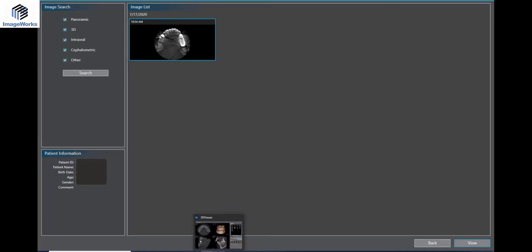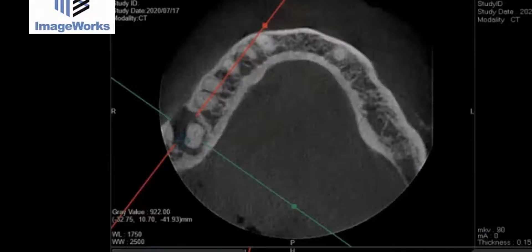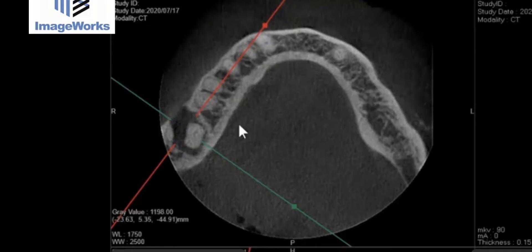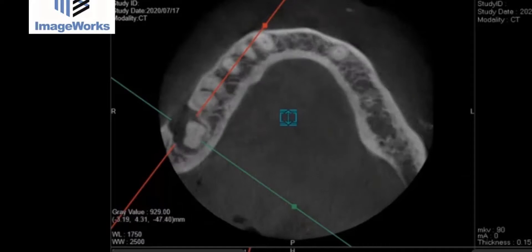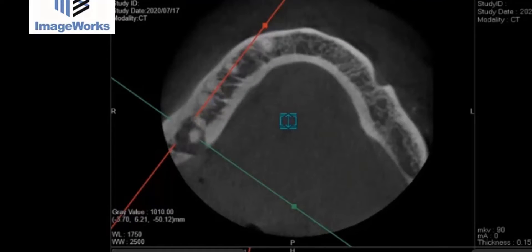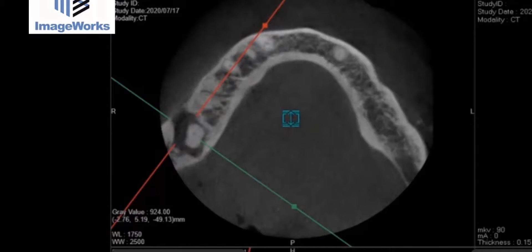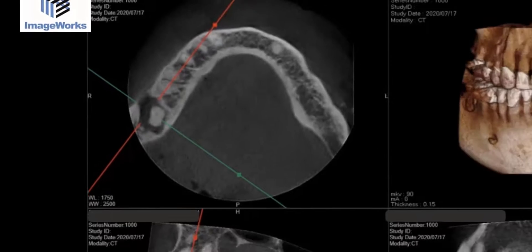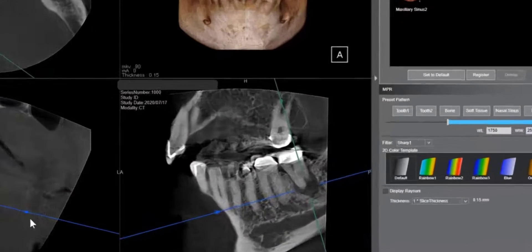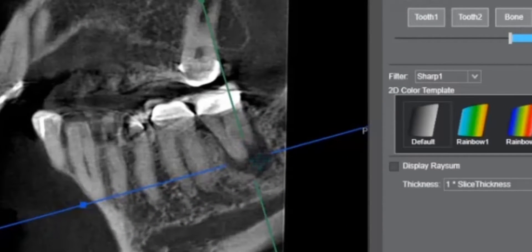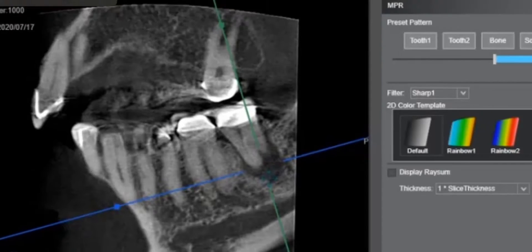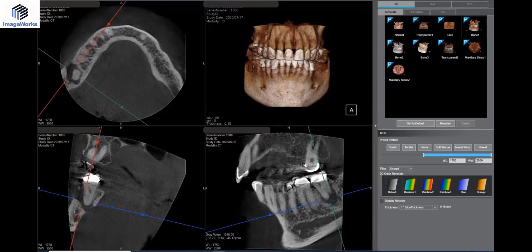In the cone beam, this is the tooth here, and you can see the buccal outlet going through all the way to the lingual — so it's through and through, both sides. And this is how it looks from this side as well.